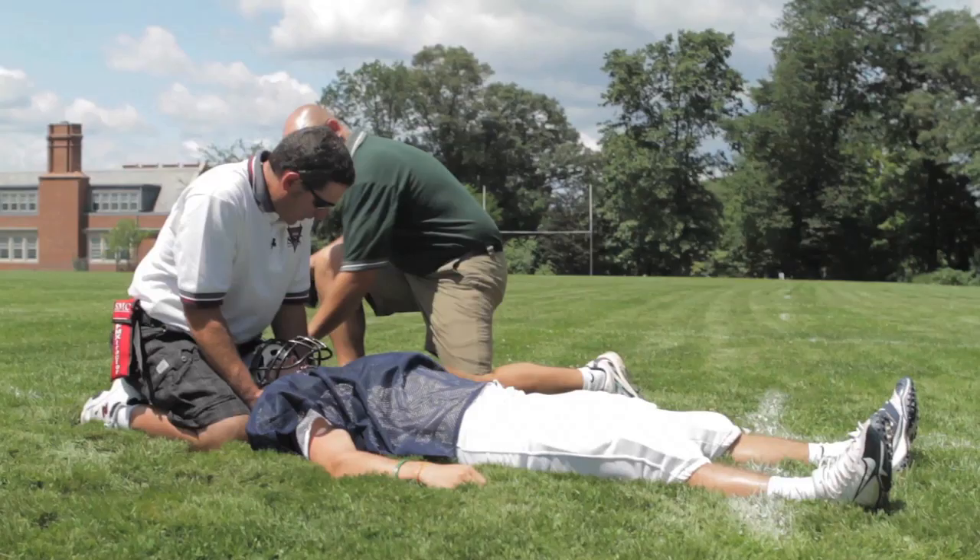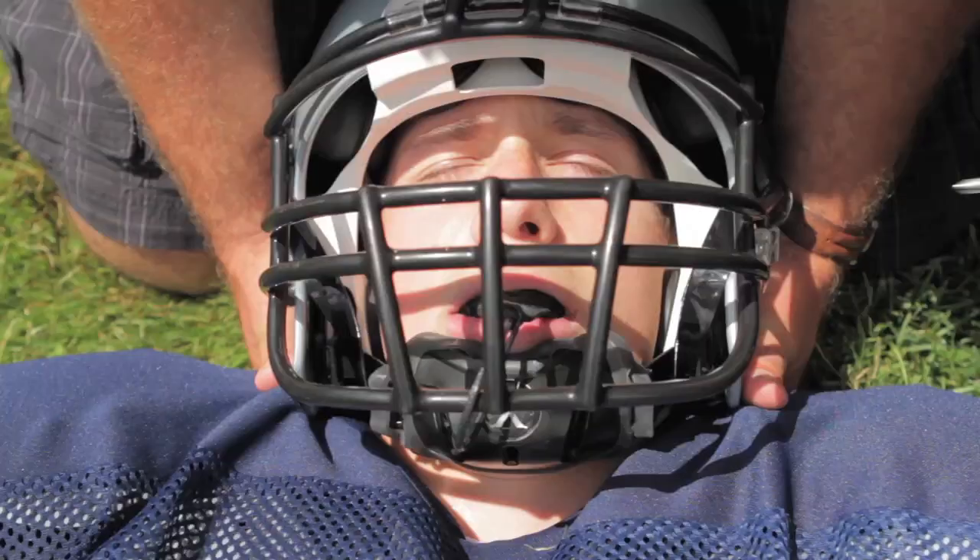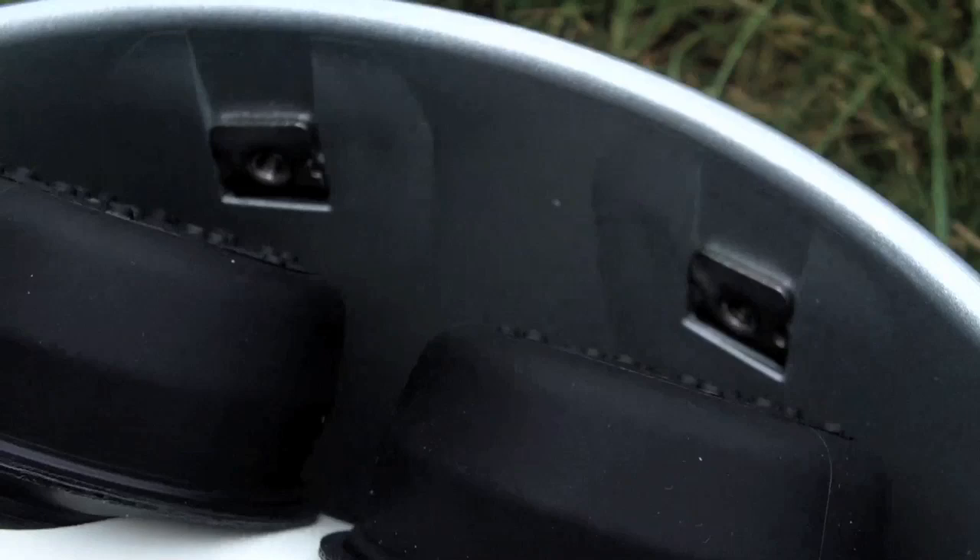If we decide that it's necessary to remove the face mask to gain access to the injured athlete's airway, we do so by using a power screwdriver to unscrew the hardware from the face mask clips. Okay Peter, what we're going to do — we're going to take those screws out on the face mask and get that face mask off. The X1 is equipped with T-nut blockers that hold each T-nut in place so they don't spin during removal of the screws.